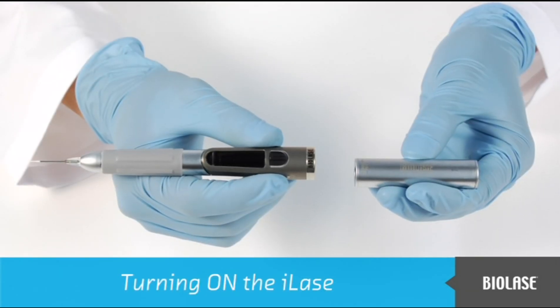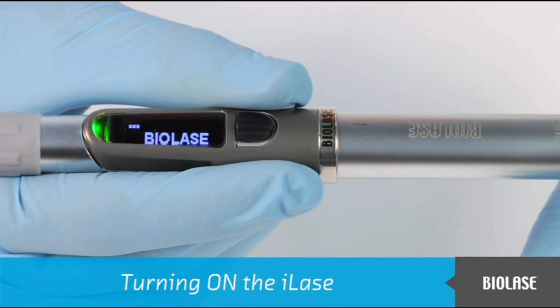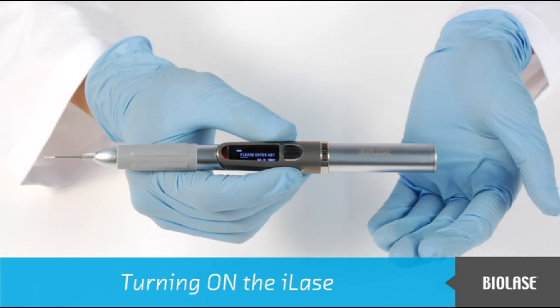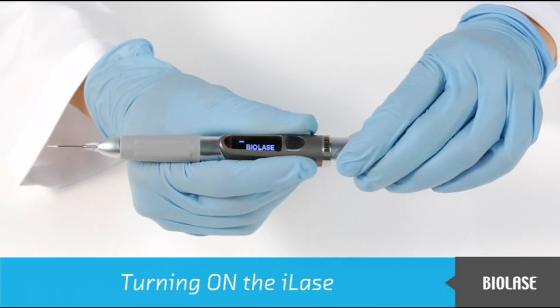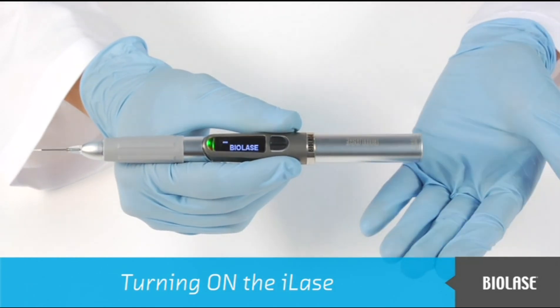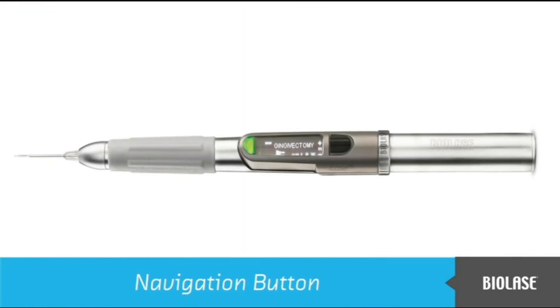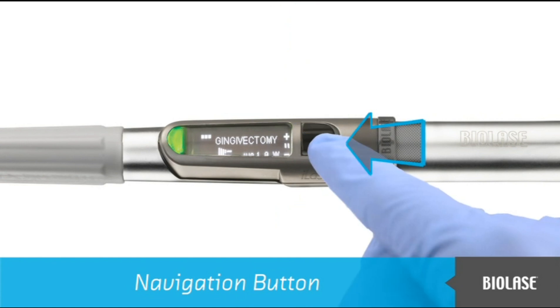The iLaze rechargeable battery easily attaches to the main body. The battery snaps in magnetically, and there is no need to twist or tighten it. Either side of the battery may be inserted into the main body — there is no positive or negative side. Once attached, you will use the black navigation button to control the system. The black navigation button has three positions: up, down, and pressing in.